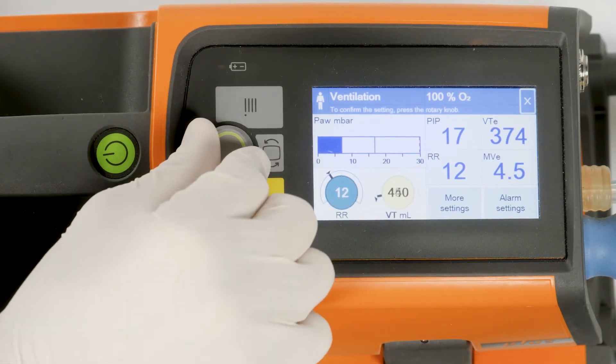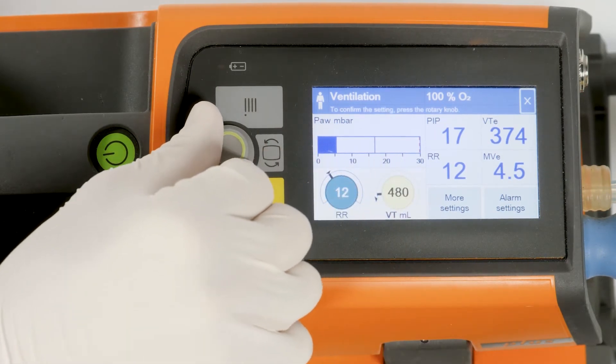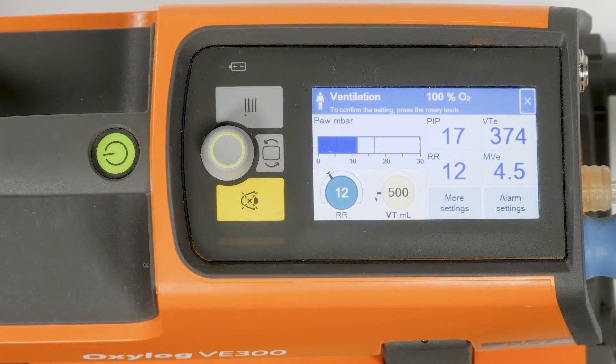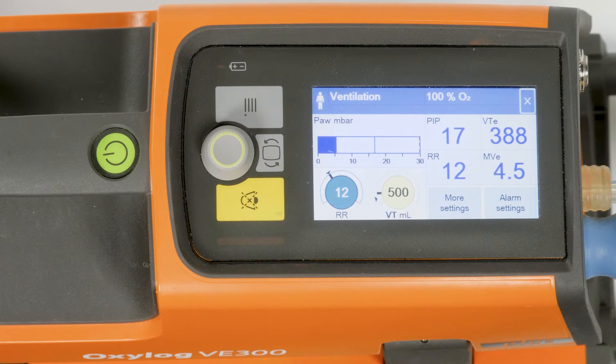A low priority alarm is highlighted by one prefixed exclamation mark. The acoustic alarm signal consists of two tones, sounded only once.